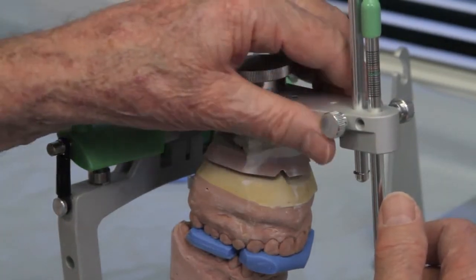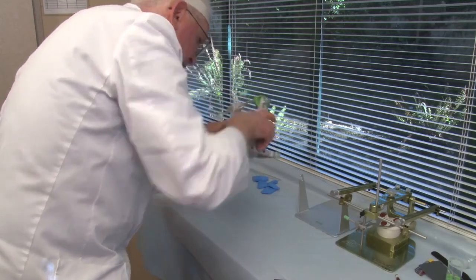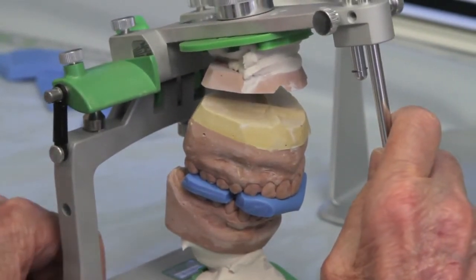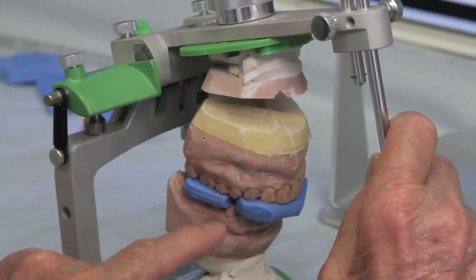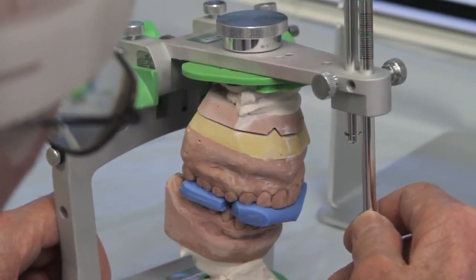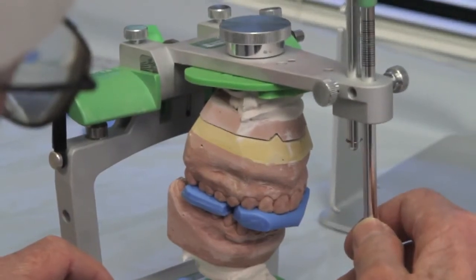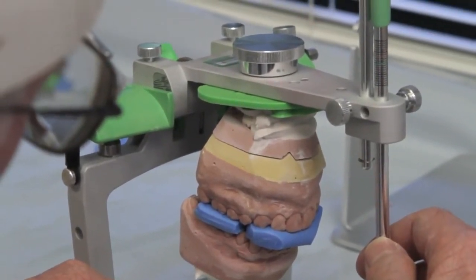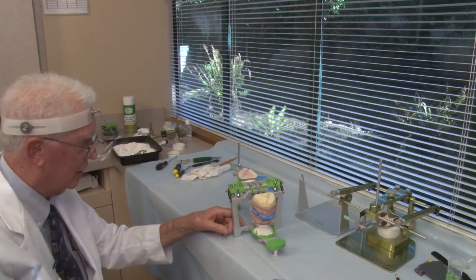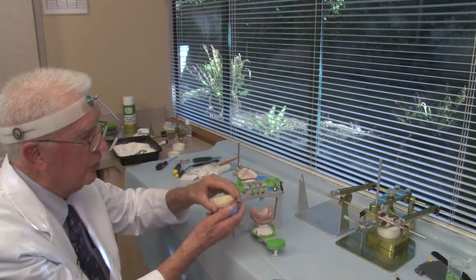Now maybe I've got it seated wrong, so I'm going to try it one more time. Be closer this time. The first time I showed you just now, I didn't have the wax bites seated good. I could tell when I seated them a second time, they seated much more clearly. And so now you can see that it's getting closer, but now it's touching. And you see it's still not seated. See that? See the space here? And I can feel that it's touching the upper model. So that is an inaccurate set of wax bites as compared to the actual mounting. That's the reason you use split cast checking and verify, having a technique to verify the accuracy of your work. So this wax bite is no good.